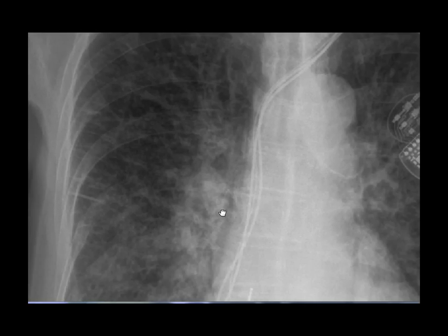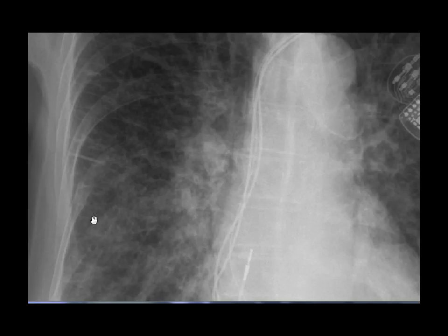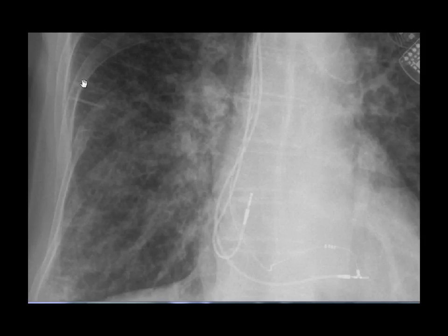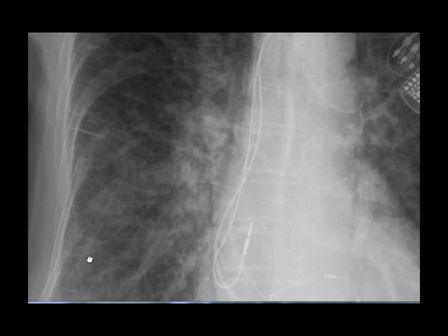Blood vessels, by contrast, are widest at the hilum. As they branch off and move towards the lateral chest wall, they become smaller and smaller — in fact, towards the chest wall they become so thin that they are not visible on a normal chest X-ray.